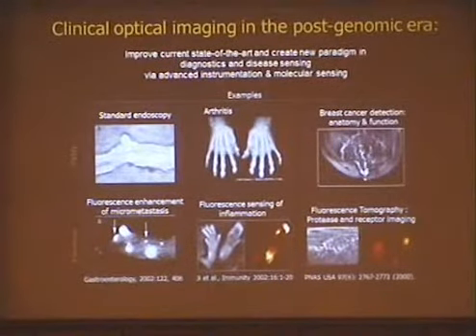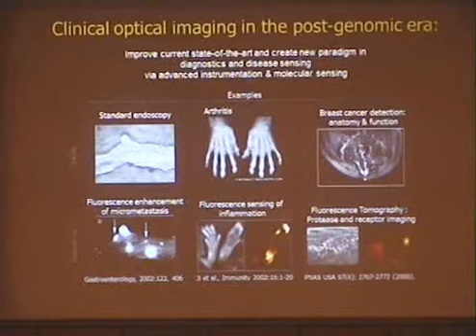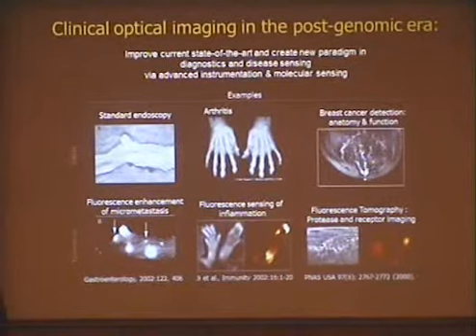Now, there are many things you can do with these things. And obviously, I know of interest to this audience is probably endoscopy. So instead of seeing anatomical features or more developed disease already, because even the flat adenomas are already developed disease, maybe even see earlier markers and identify them based on the fluorescence. So you can start seeing very small microfoci of disease rather than the bigger polyps, let's say.